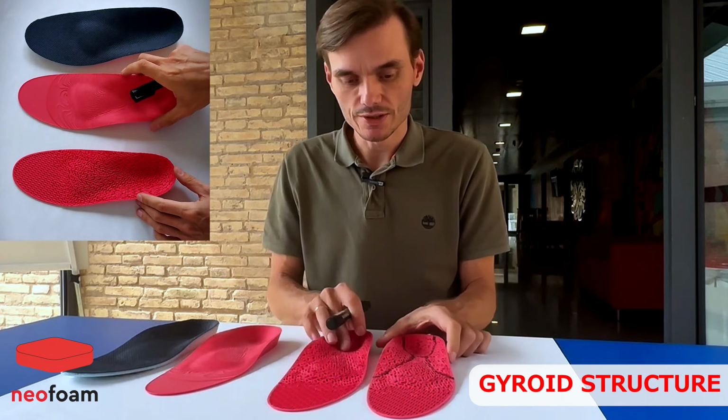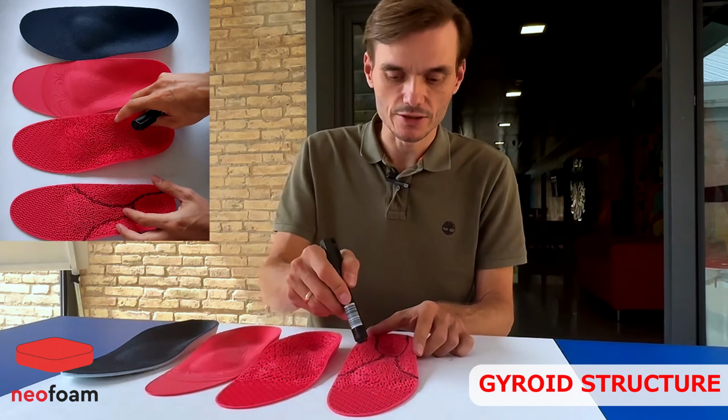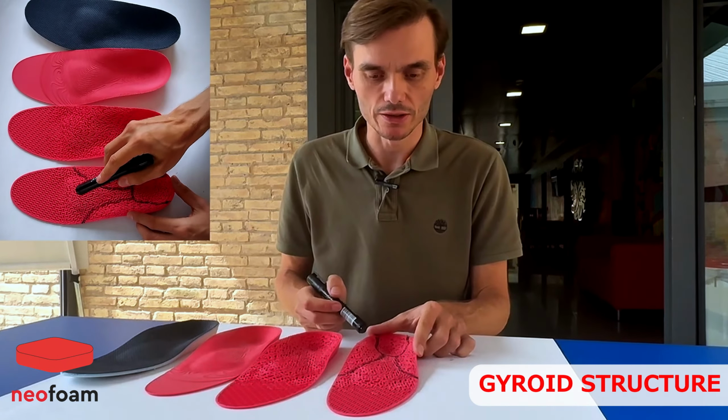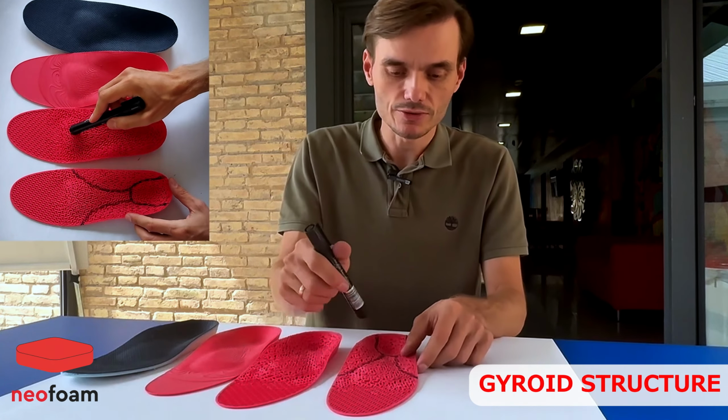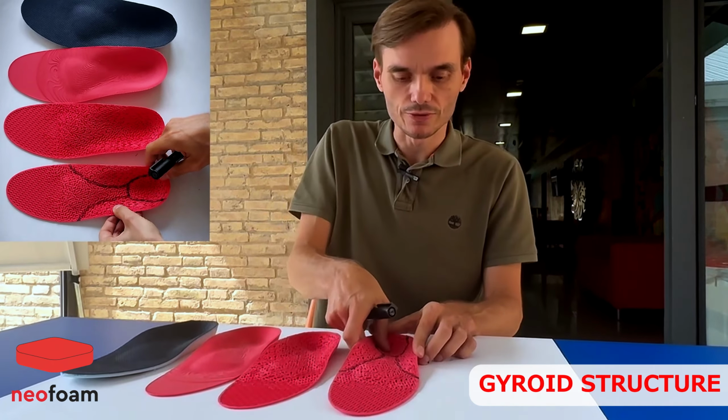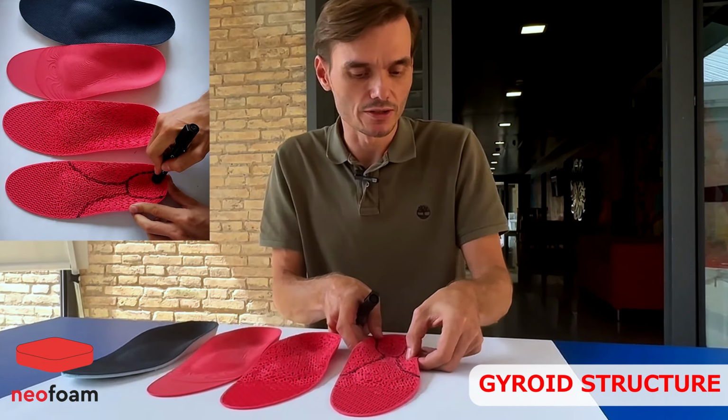What we can do is change the density of each area without any borders, with a gradual transition from one area to another one, and as a result we can make it hard here, softer here, super soft here, and some other density in other areas.